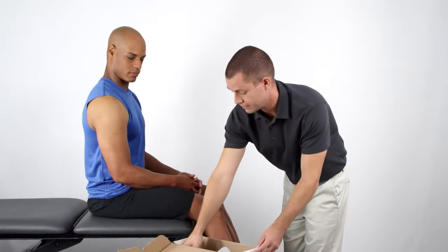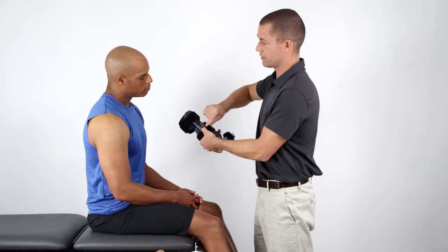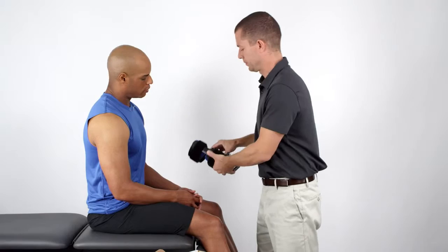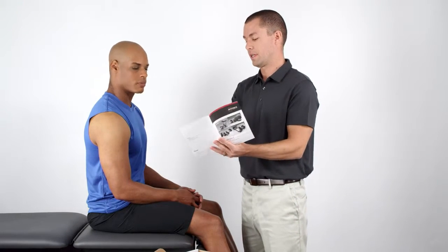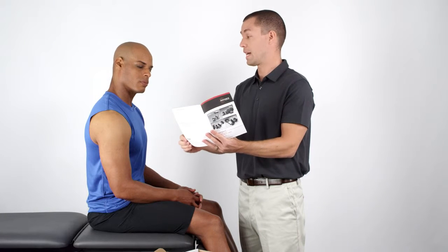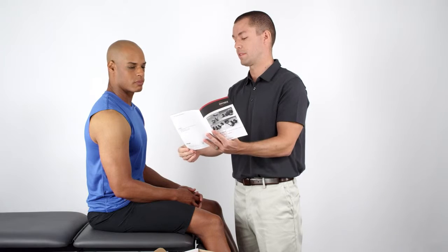After you remove the device from its carton, check the labels on the inside strut to make sure you have the correct unit. Then review the features of the Advanced Wrist Orthosis. The instruction manual features a diagram that explains the components and performance benefits of the device.